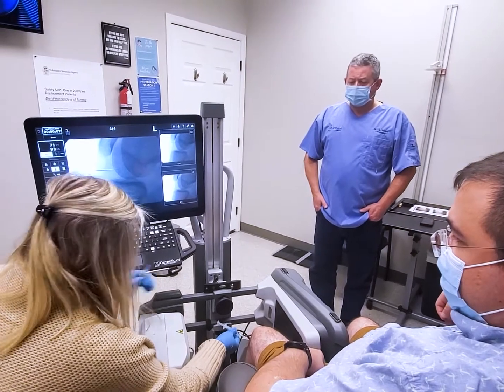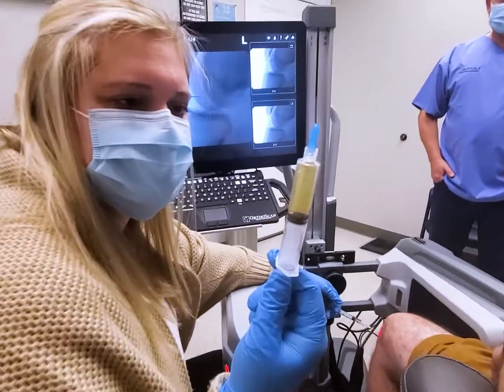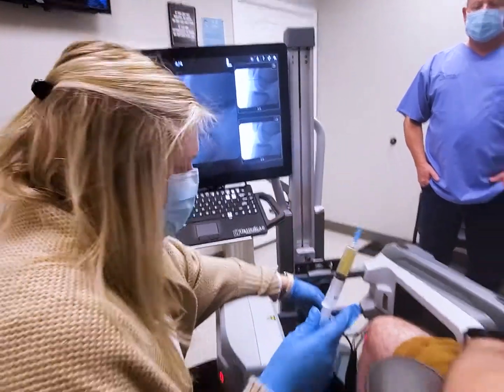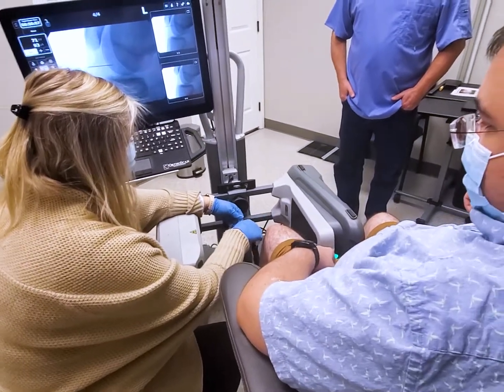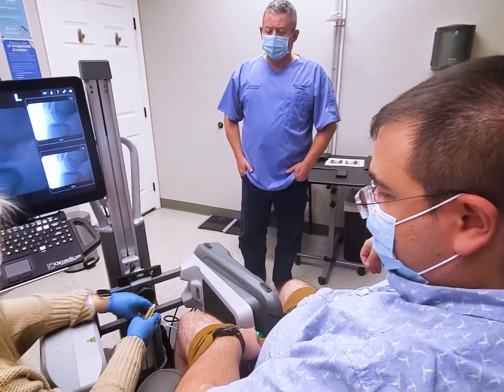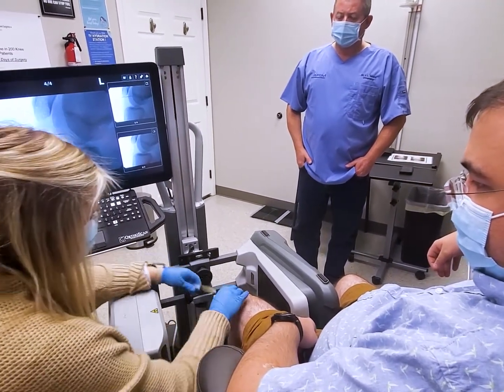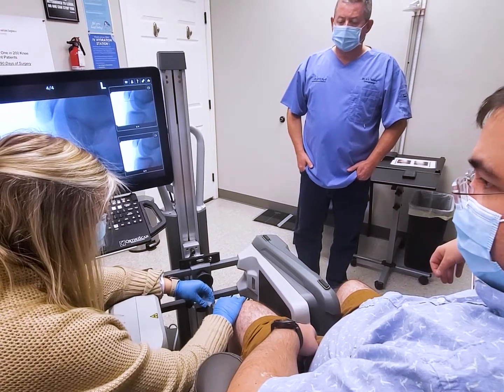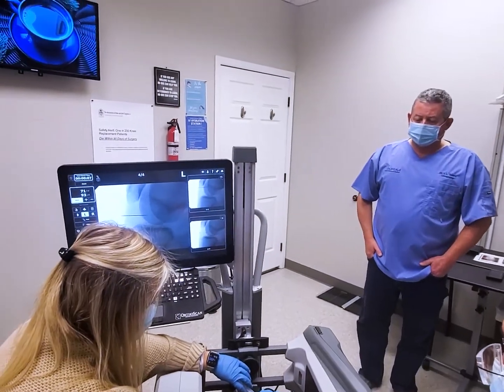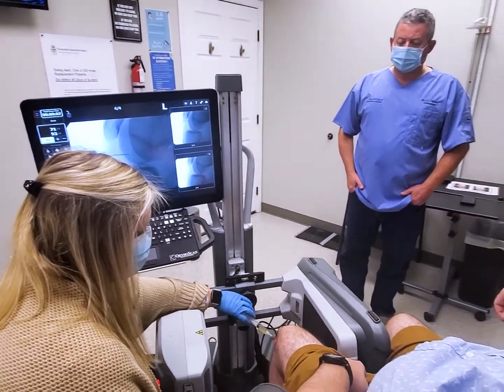Okay. So this is the actual prepared platelet rich plasma. We use the same exact needle that I just used the lidocaine with. So you only get one poke. Then we just slowly inject.